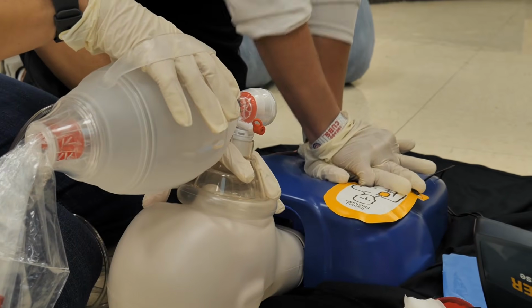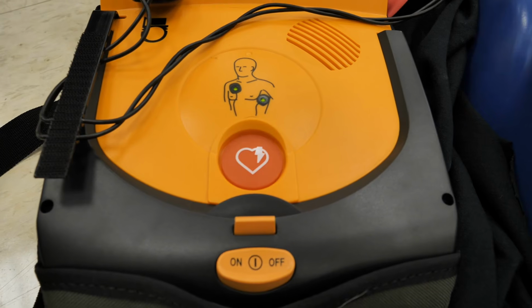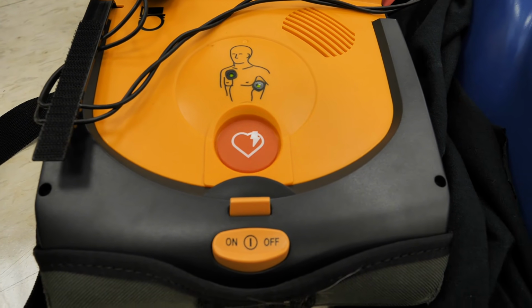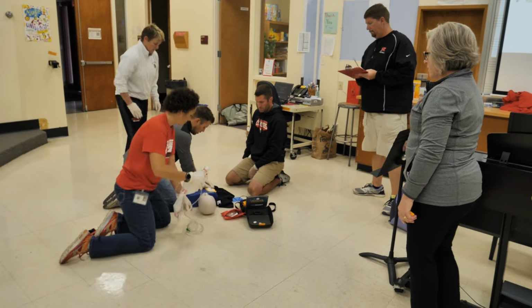Everyone clear. Back up, patient. Everybody back up. Evaluating heart rhythm. Everyone clear. Press flashing button. Everybody back up. Shocking. Shock delivered. Provide chest compressions and rescue breaths.